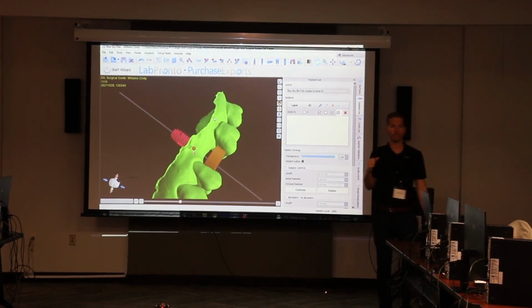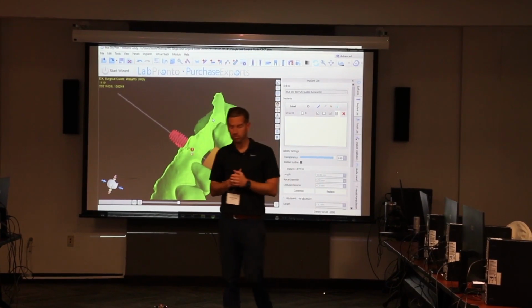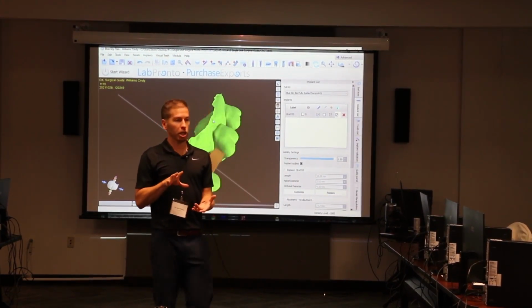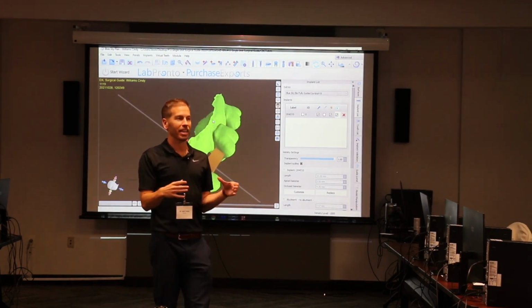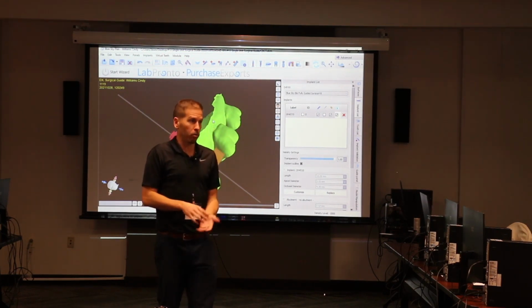The sleeve with the guide. How do you secure it? So, yeah, that's a good question. In a perfect world, it's friction fit. It's just pressed in there. But then you think about, again, that calibration: if the resin is too tight, you can't get the metal sleeve in, you've got to go and ream it out, which is annoying, right?